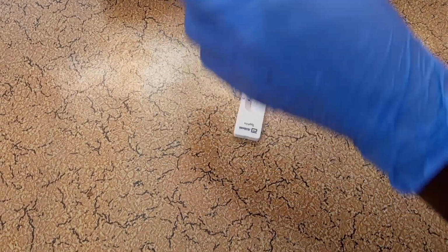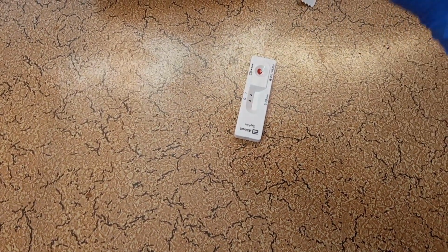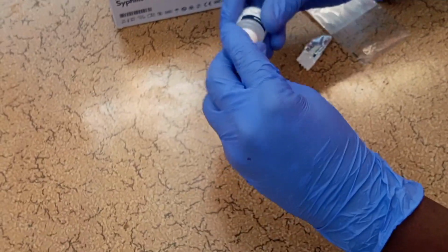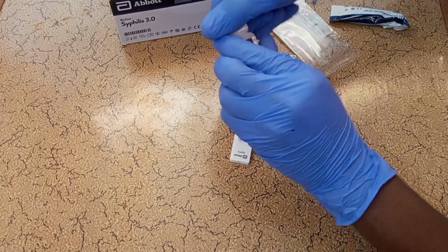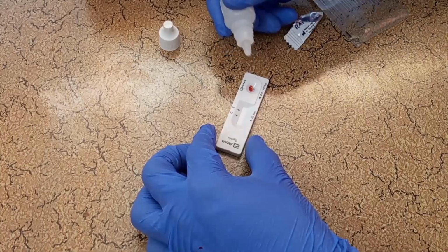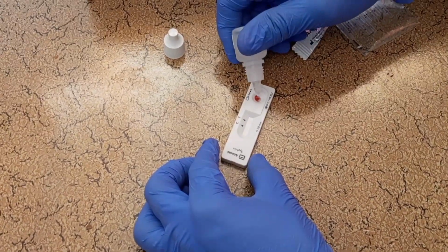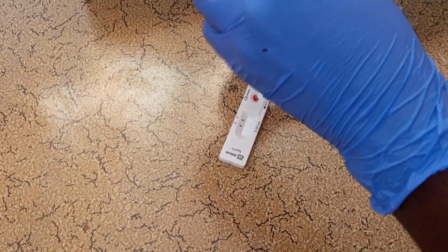Then you get your buffer, and you pour 3 drops into the buffer window.